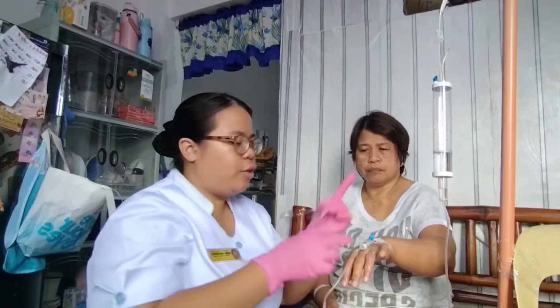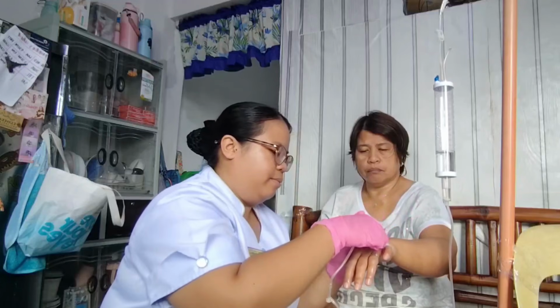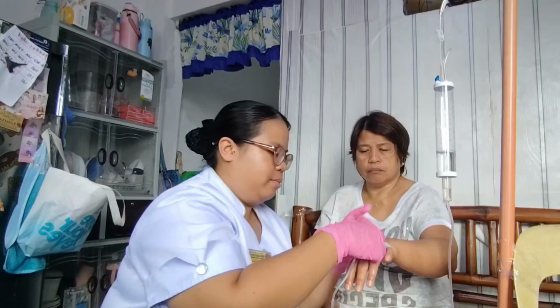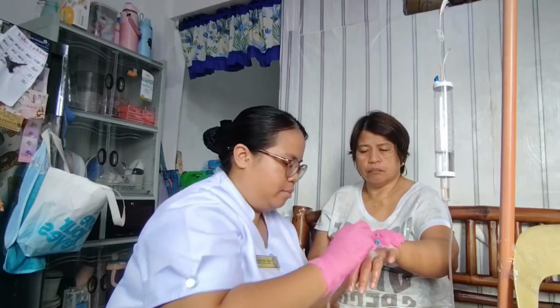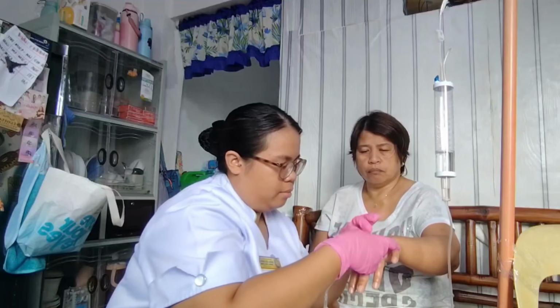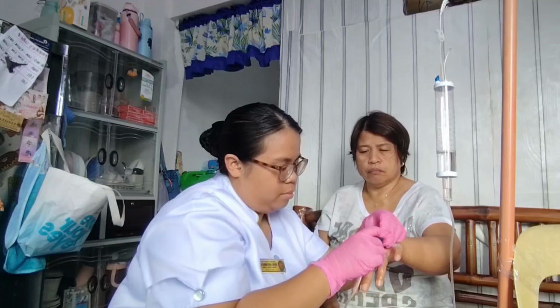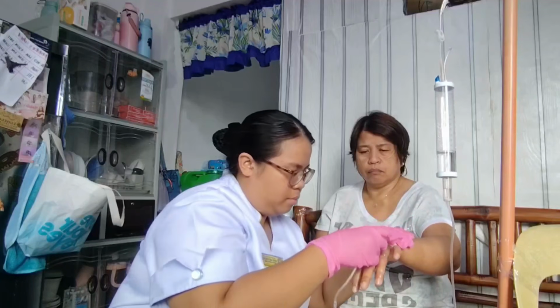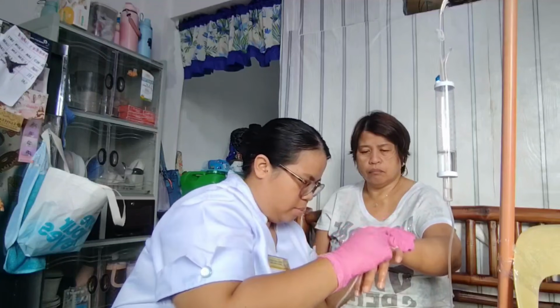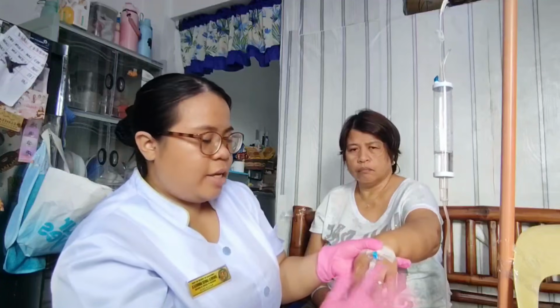Make sure that it is secured so that it will not be pulled out easily. Okay, so now it is secured.